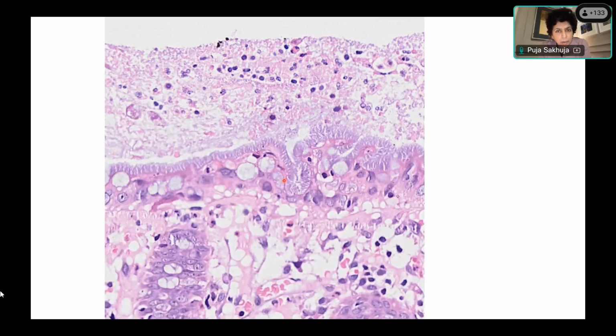It's not a diffuse fuzziness, it's very distinct fuzziness, which gives you a very strong suspicion. Otherwise, sometimes even the mucin on the surface can give this fuzzy appearance, but it blends in and is not distinct like each spiral form here. So this makes it very suspicious.